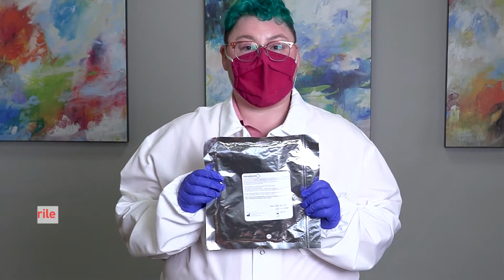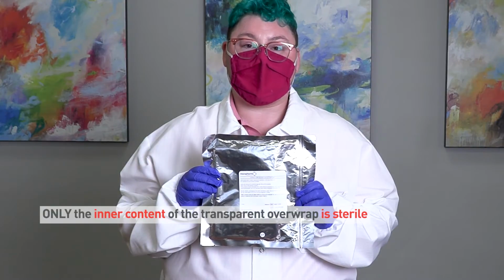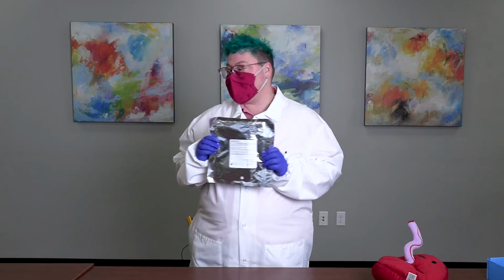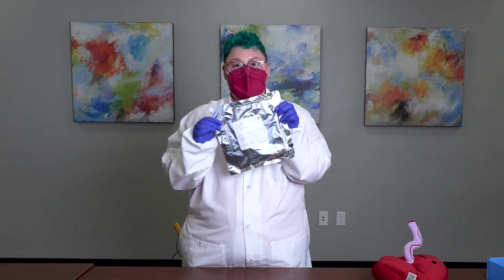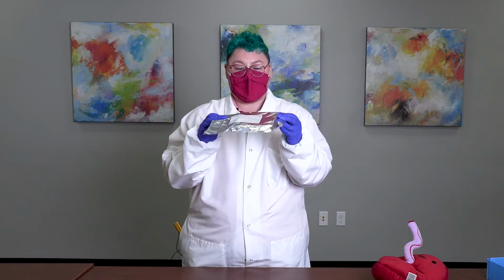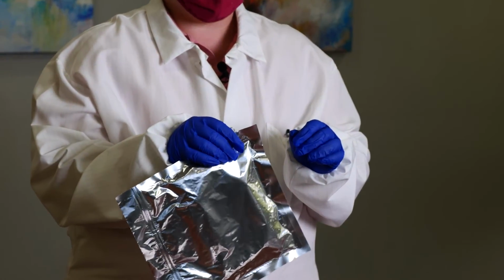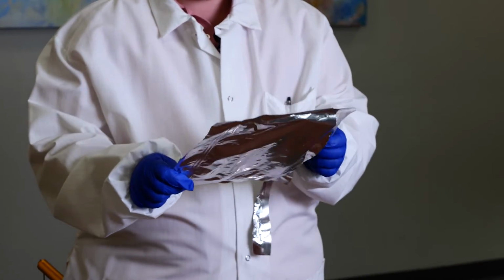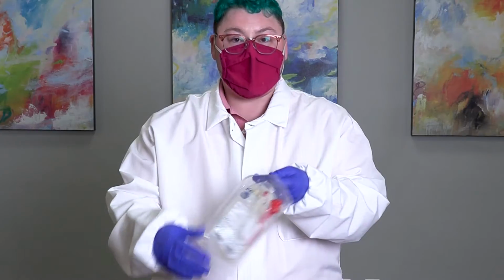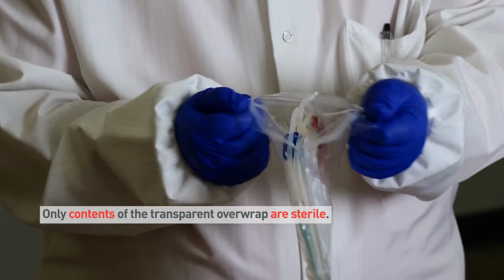This collection bag is sterile and can be used for cesarean deliveries. The collection bag may also be used for vaginal deliveries as well. Before doing the collection, you want to evaluate this aluminum pouch to make sure there are no tears or openings. Before entering the delivery room area, open the silver pouch and remove the inside. Once in the delivery room area, you'll open the transparent pouch. Inside, it is sterile. It can be dropped onto the sterile field.